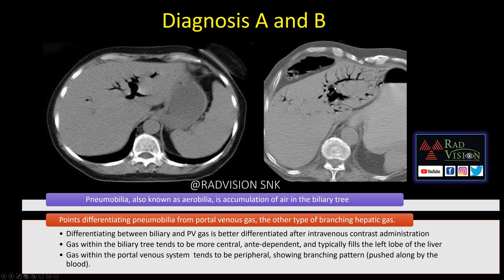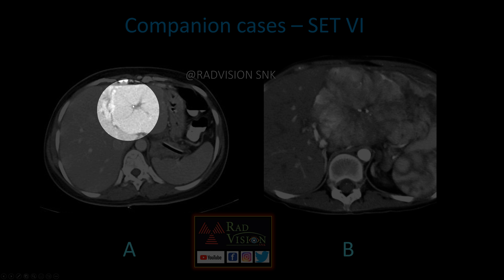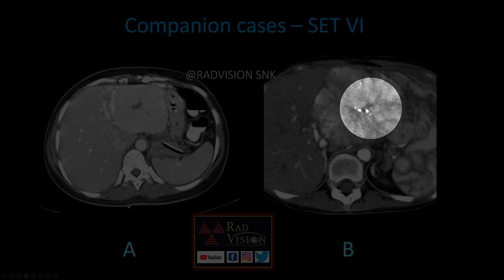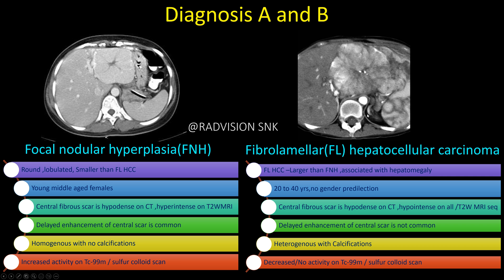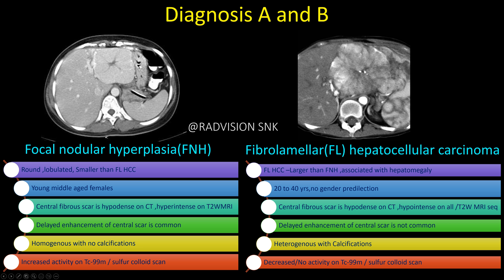Next case shows a well-defined lobulated lesion with a central hypodense scar and radiating bands — this is FNH. The other case shows a large lobulated lesion with a central scar showing calcifications — this is fibrolamellar hepatocellular carcinoma. FNH is smaller, common in young middle-aged females, with a hypodense central scar that is hyperintense on T2 with delayed enhancement, homogeneous, no calcifications, and increased Tc-99m sulfur colloid activity. Fibrolamellar HCC is larger, seen in 20–40 years with no gender predilection, central scar hypointense on all MRI sequences, no delayed enhancement, heterogeneous with calcifications, and decreased sulfur colloid activity.